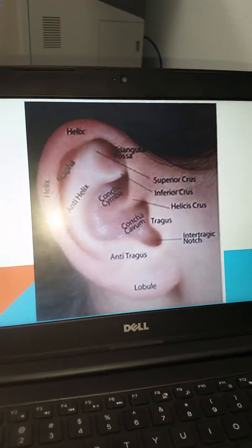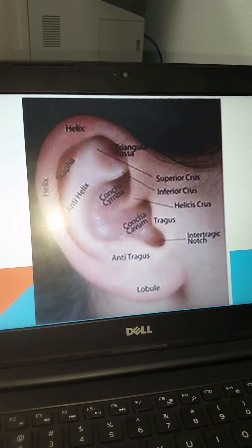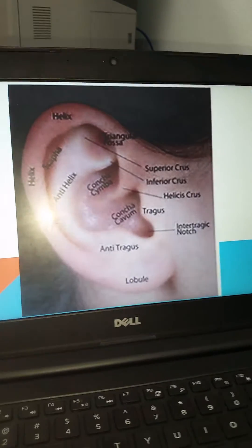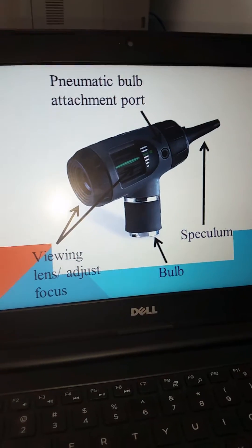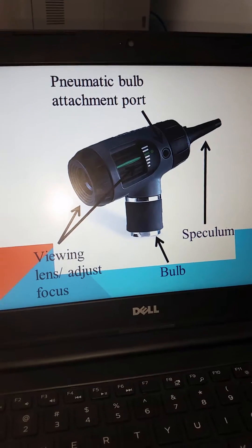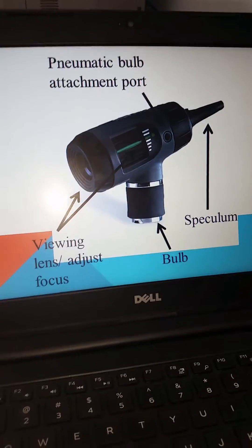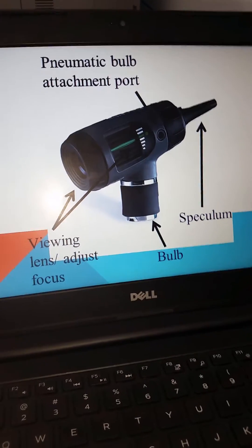On your examination of the external ear, make sure that all of the above structures are present and be aware of piercings and other body modification. Remember the tool you're using is your otoscope primarily, with the viewing lens and adjustment focus, your clean speculum, and note that some of these will have a port on them for the pneumatic bulb attachment port.